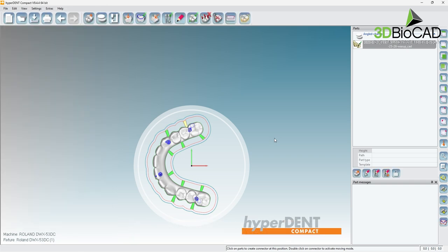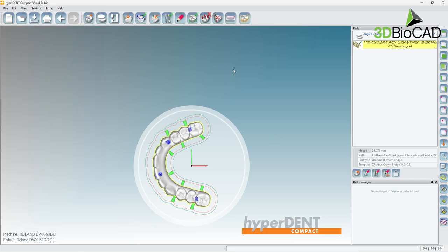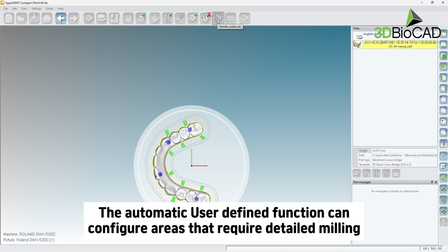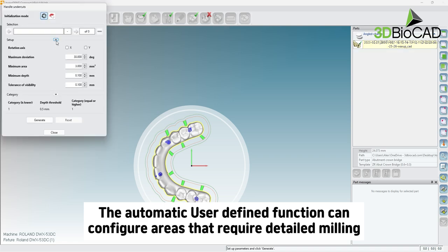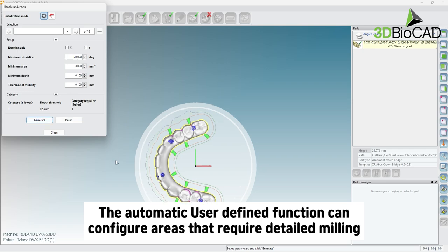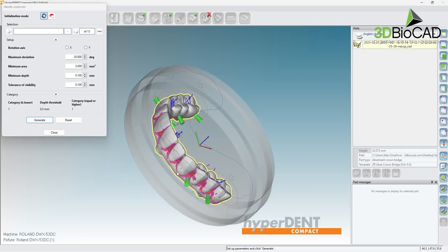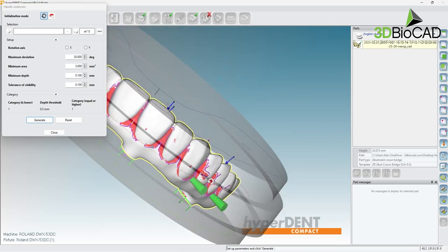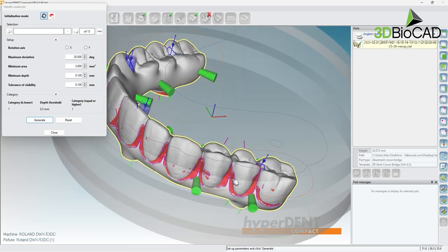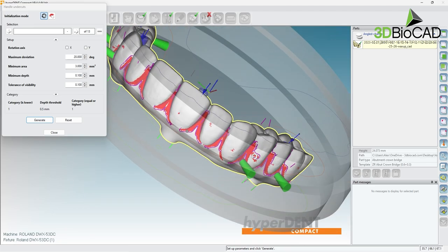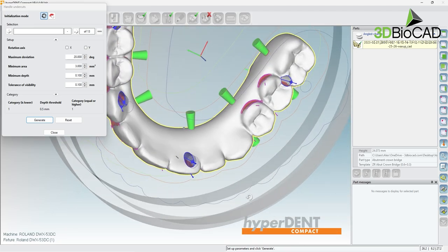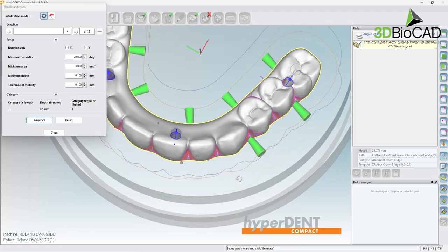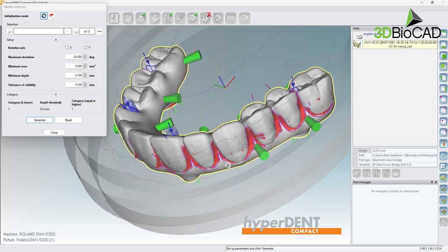Using the automatic user-defined will help us prevent undercuts. To do this, choose the handle undercuts option, then select setup and provide preferred settings. After generating auto user-defined, you will not be able to adjust connectors.